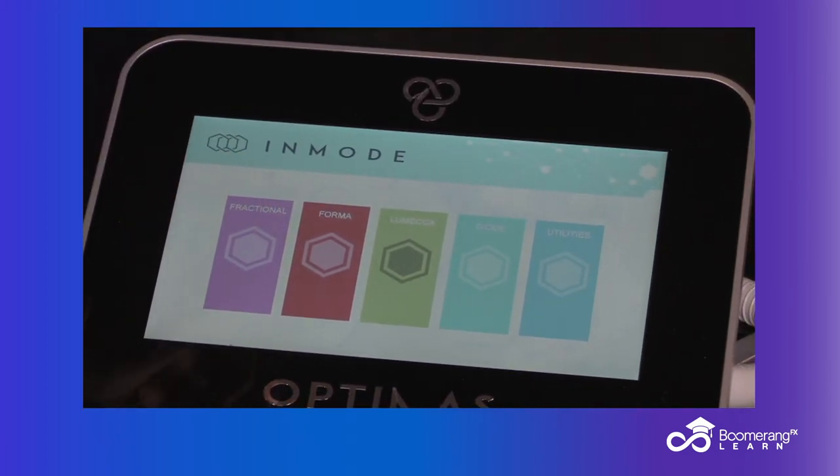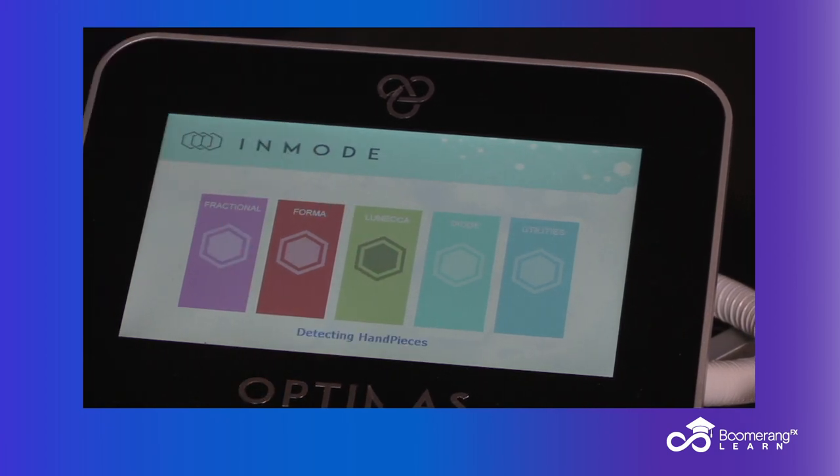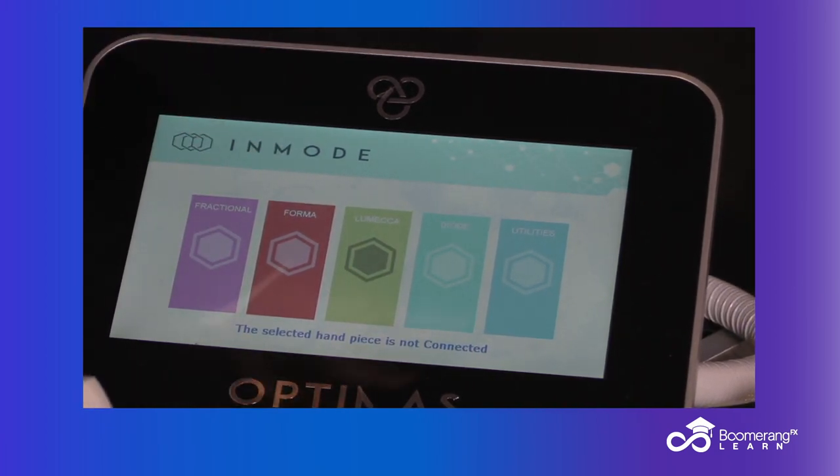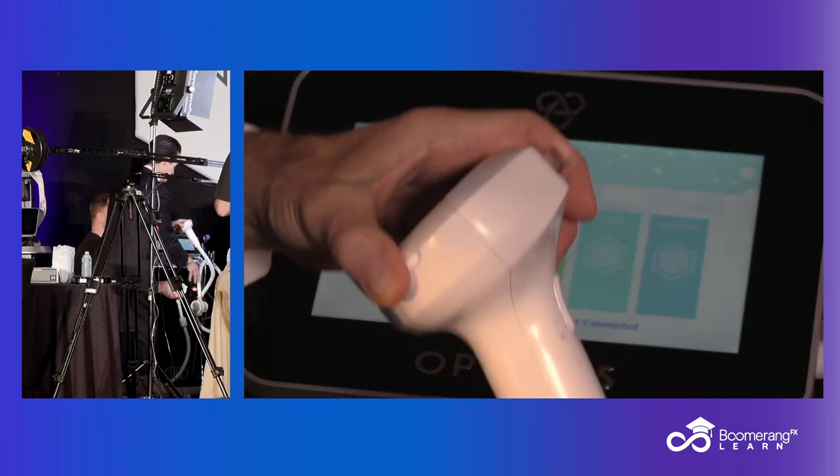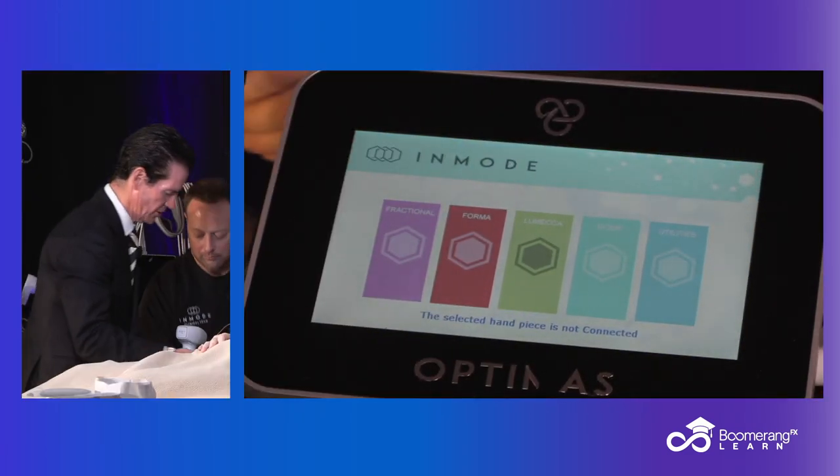We're going to give her some nitrous oxide because photofacial kind of stings — we want her to have a comfortable experience, so she tells her friends, "Wow, what a great clinic, you guys are awesome." It's a good thing if I plug it in — it works a lot better with electricity.